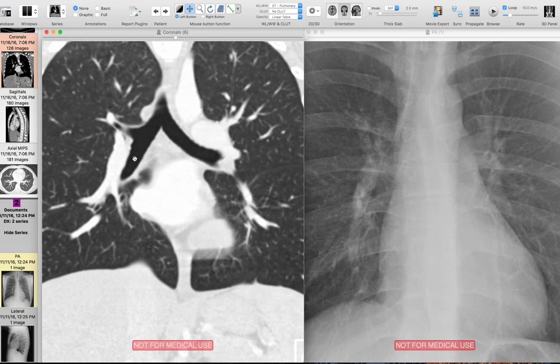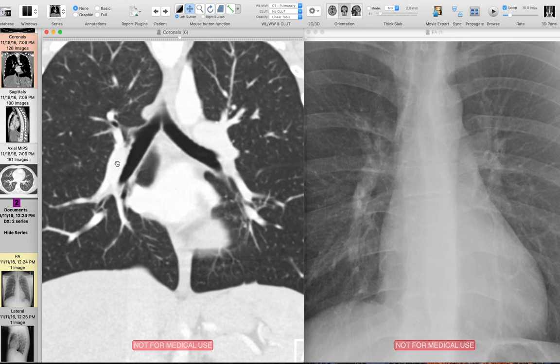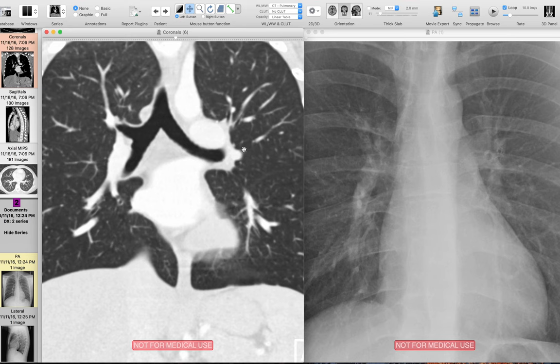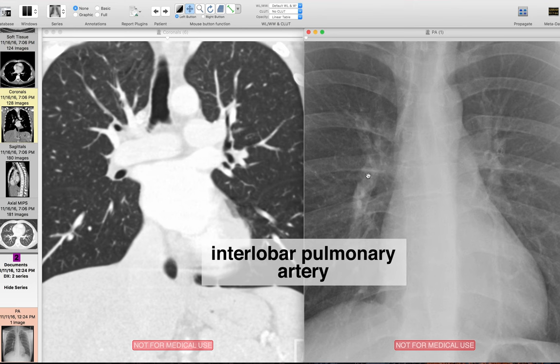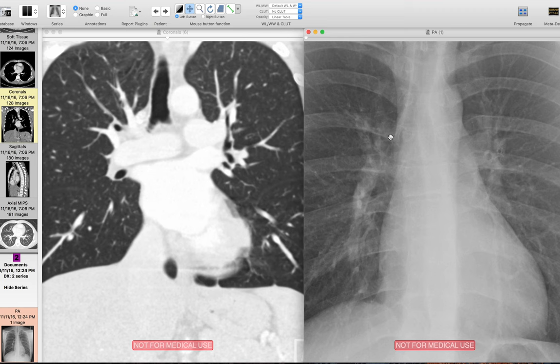There's another bronchus we can see inconsistently — the right upper lobe anterior segment bronchus, which appears as a ring shadow in the hilum. Scrolling forward on CT confirms that structure as the anterior segmental right upper lobe bronchus. To summarize the right hilum: we have the right interlobar pulmonary artery, right superior pulmonary vein, truncus anterior, right main bronchus, right upper lobe bronchus, bronchus intermedius, and the hilar angle. That covers the right hilum.